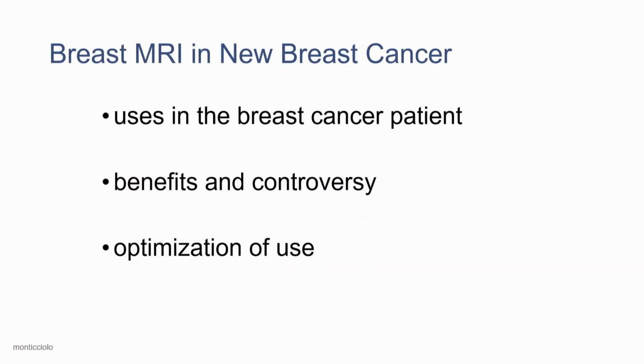Okay, so what we're going to cover in this talk are the uses of breast MRI in the cancer patient, benefits and controversy. We'll go over some of the discussion about whether or not to use it, and then we'll finish up by talking about ways to optimize use.